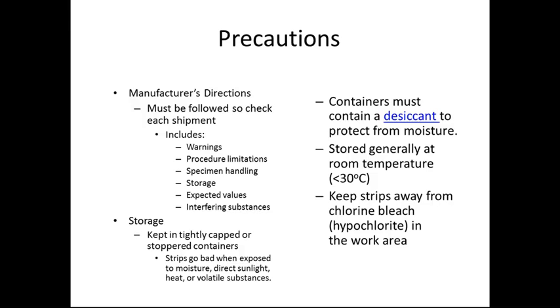Storage: oftentimes we store these at room temperature, in a dry place, not in direct sunlight, away from moisture. We also should keep the strips away from chlorine, bleach, or hypochlorite. They should not be stored in the same area.